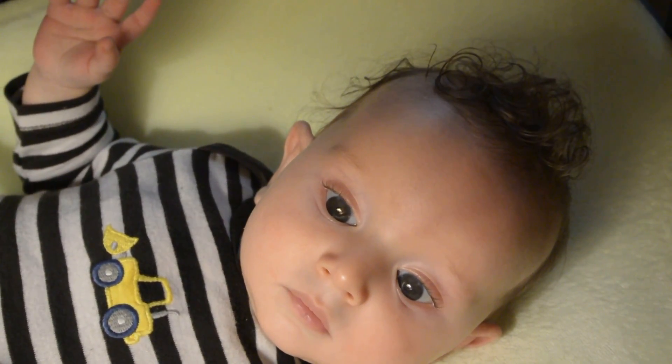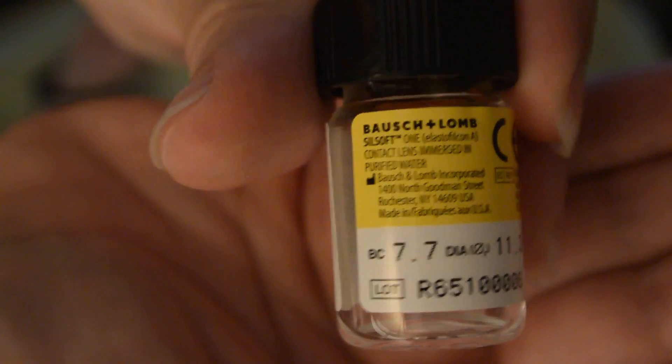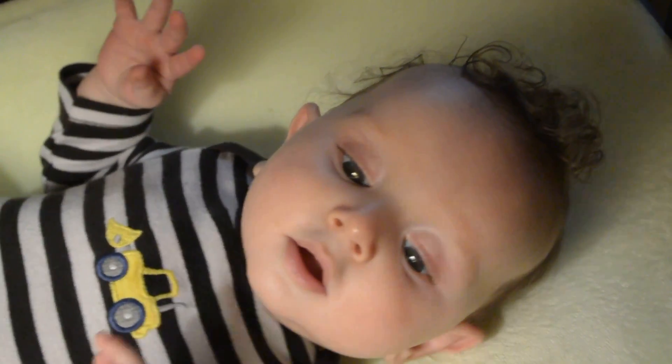He wears Silsoft contact lenses. This is what the packaging looks like when you get these. And this is how I put them in.